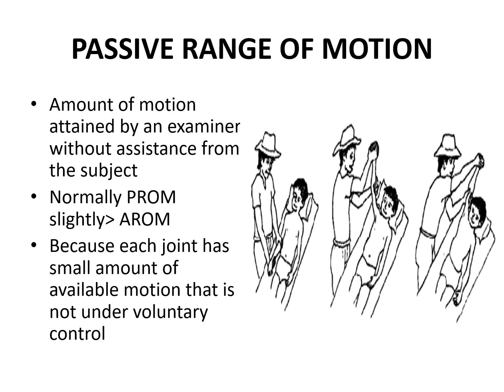So normally the passive range of motion can be more than the active range of motion, because you are also stretching certain structures so that you complete the range of motion. Okay.